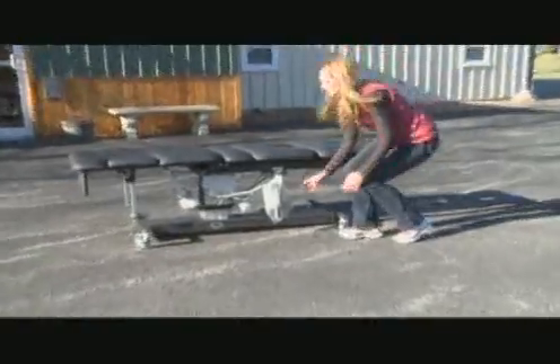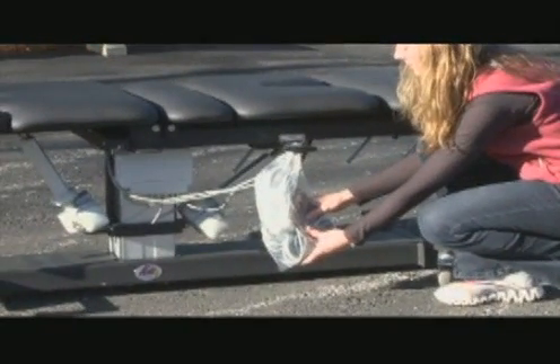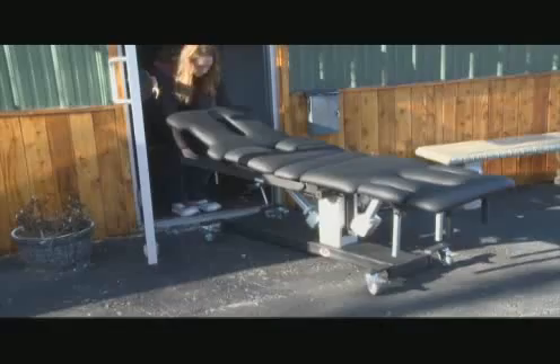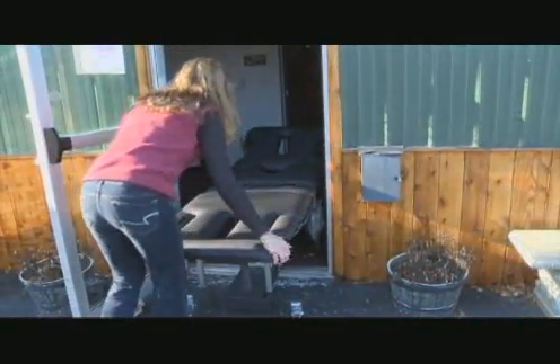Prior to moving the table, ensure that the cables and hand switch are properly suspended so they do not interfere with the movement of the table or become damaged. Unlock all the wheels and carefully move your table into your building, watching to ensure that you do not damage the cushions on the sides of the doorways.